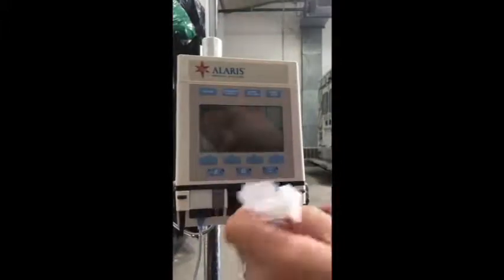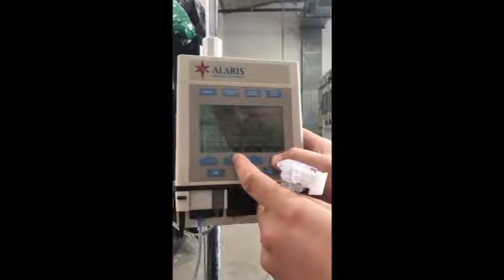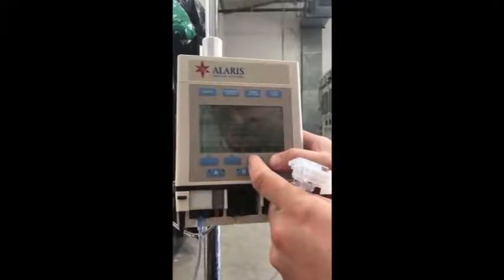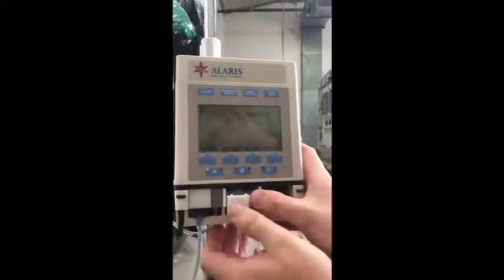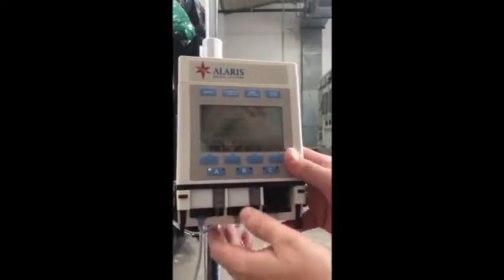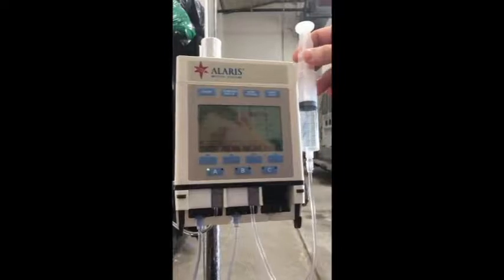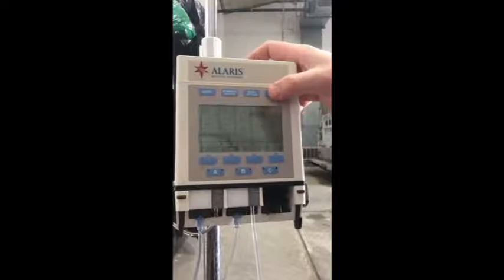So select your channel. Usually that would go right there. There's a little pocket to put them in on the pouches. And everything is set, so we can just hit start.